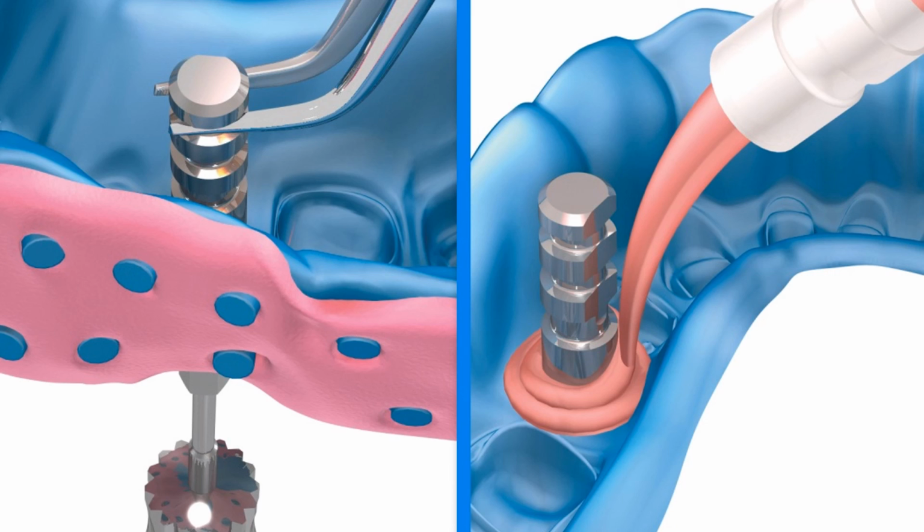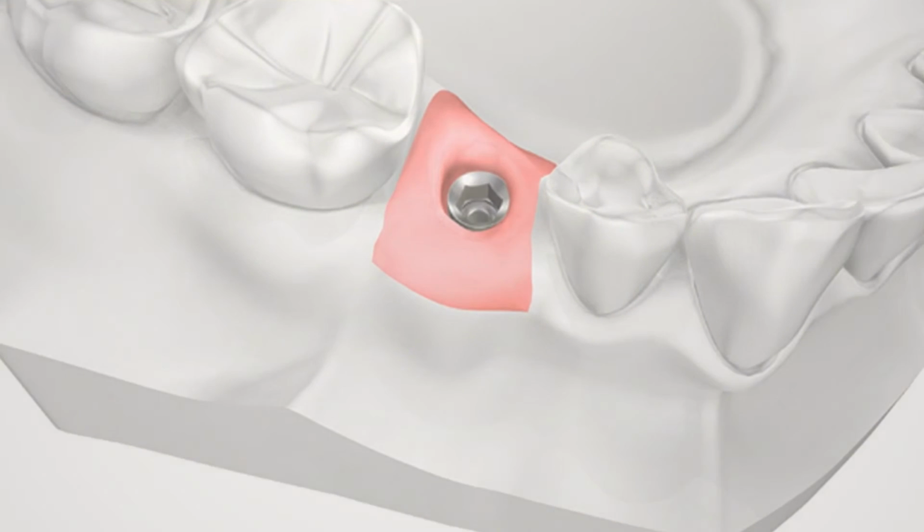and pour that up, and you have, once again, your working model to send to the lab, along with your stock abutment or UCLA abutment or request for custom abutment or prepped abutment or whatever you're going to be using in this case, and ask them to send you back some sort of prosthesis.